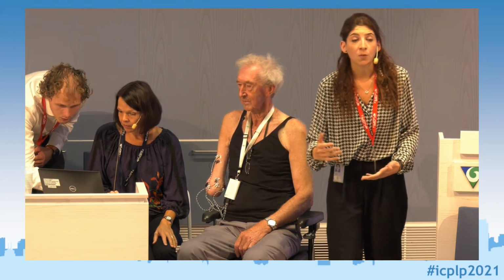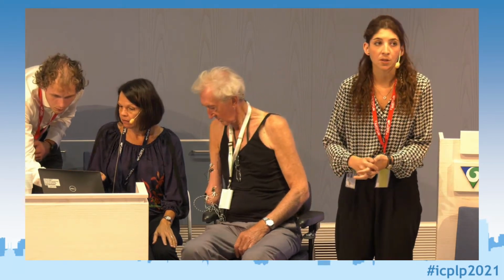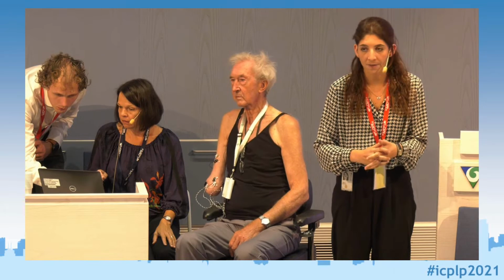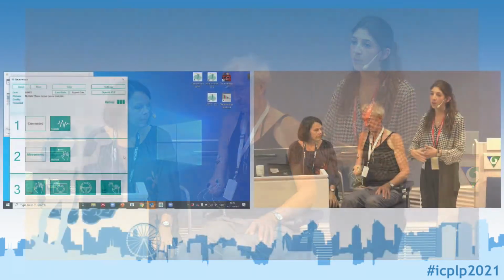But yeah, with the difference that we have between upper and lower limb, of course, both have the same principle with the electrode placement. We follow the same baseline, but of course the treatment is quite different. Something interesting that we have seen with our patients is that sometimes lower limbs take a little bit longer to get resolved.